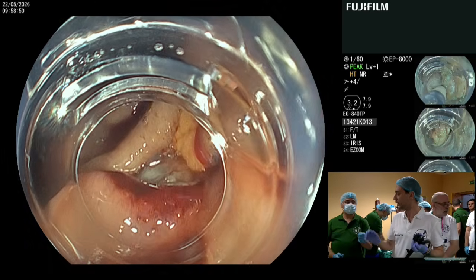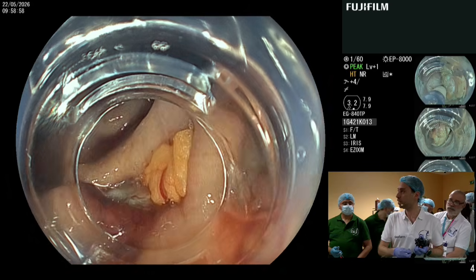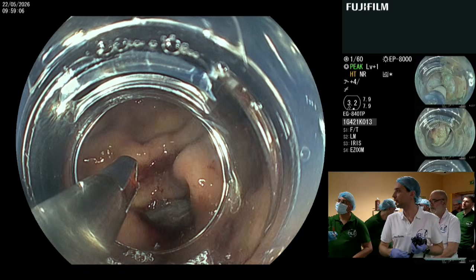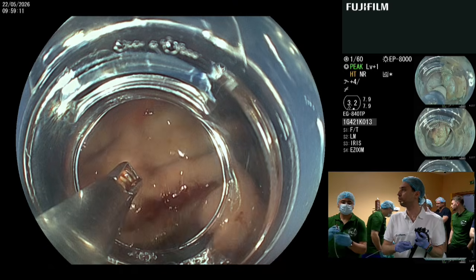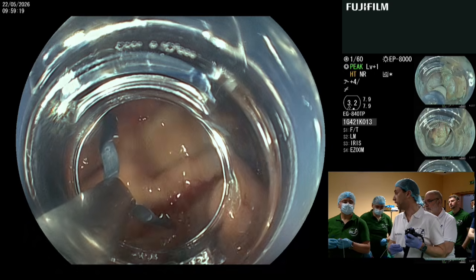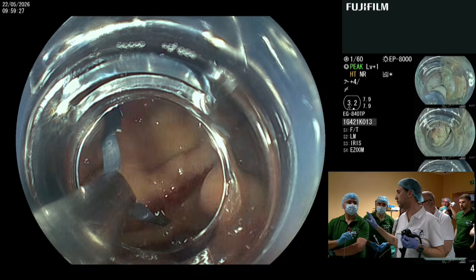Now, I will place the mantis clip, which has an anchor pronged design, and I will try to place it at the middle of the defect, and then use multiple clips around it. So I am able to rotate the clip by myself. Open it, please. So we have to use it very carefully. You will use it like a biopsy forceps. You will place it when I say deploy. When I say close it, you will close it in the same way you close a biopsy forceps, all right?